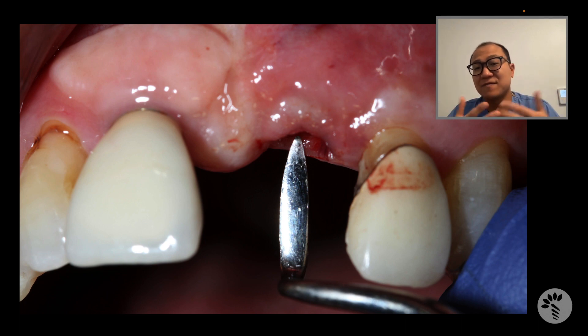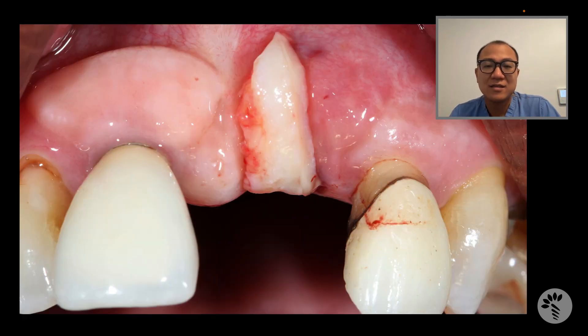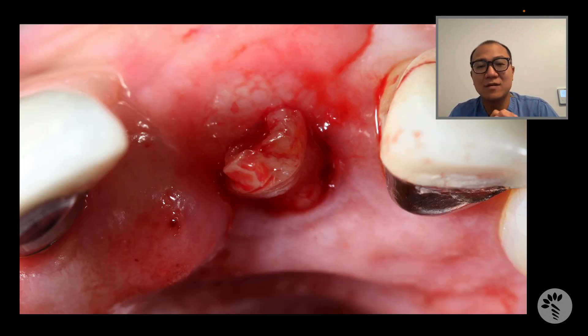I go in and create this pocket of the gum within the emergence. After that, I harvest a connective tissue graft from the palate, and into this pocket that I just created, I insert the graft.